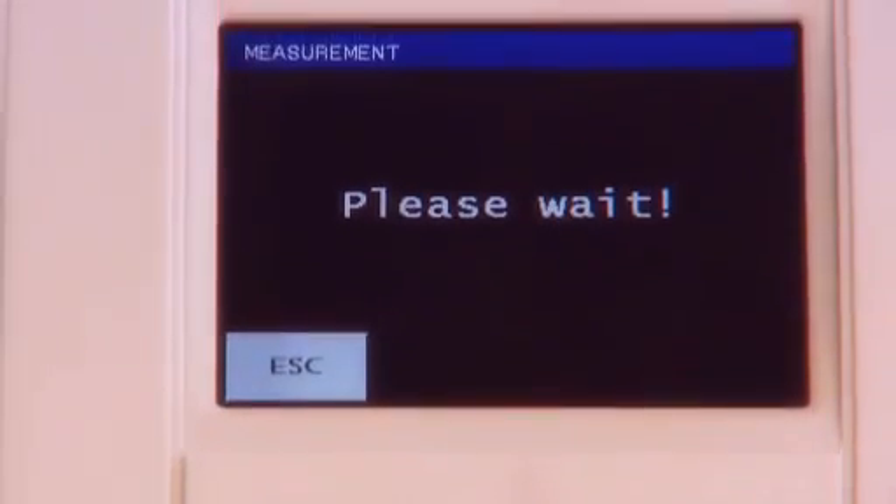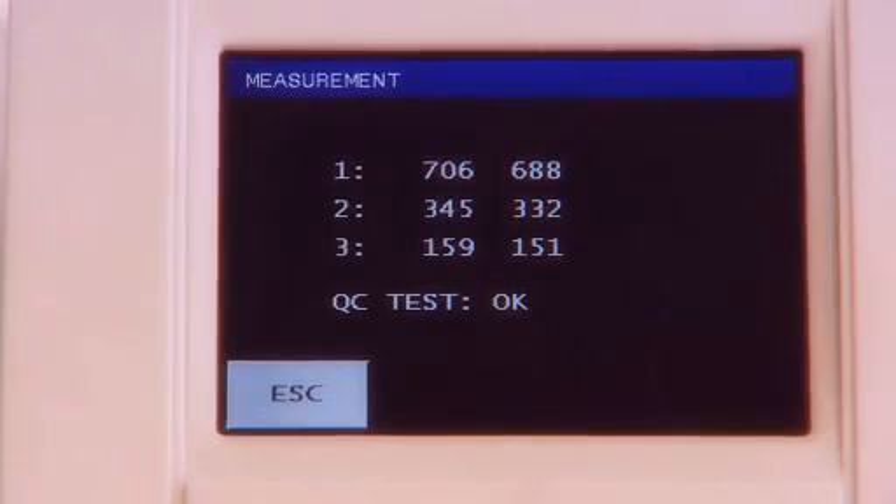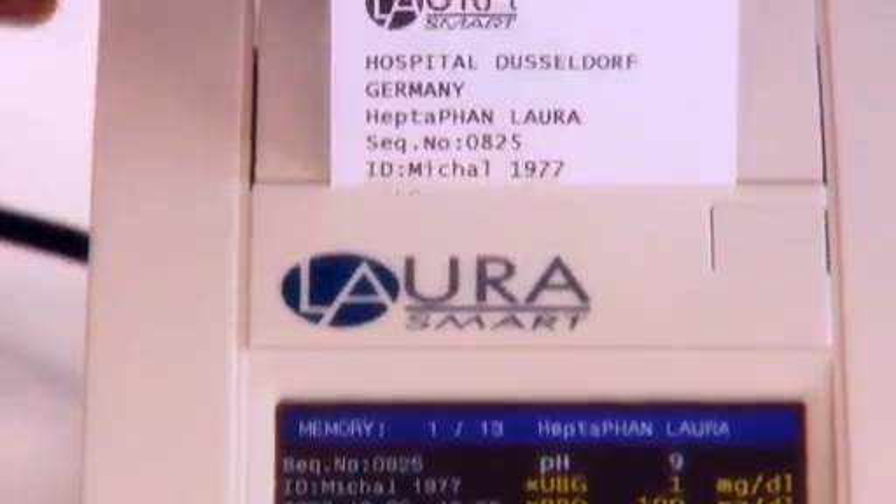Automatic calibration and checks of the LoRa smart reader are carried out after every power-up. The system checks of the optical parts are carried out by measuring control strips, and the evaluation is then printed.